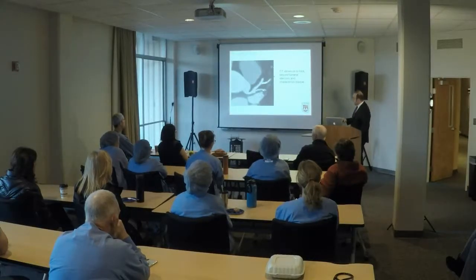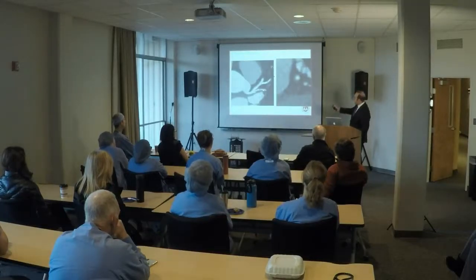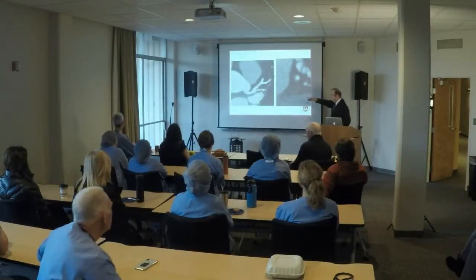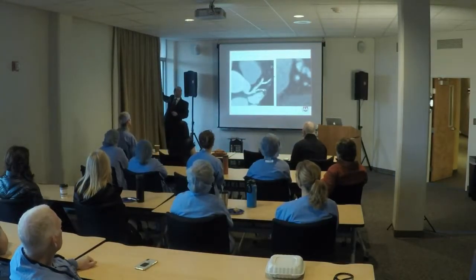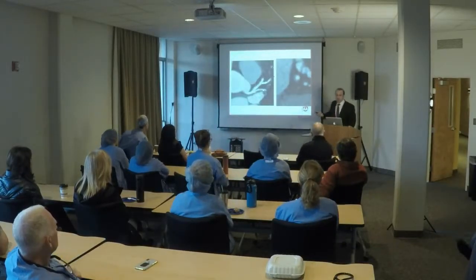Okay, and remember we were talking about how CT is a 3D acquisition. You can perform these double oblique images and perform cross-sectional views of... is there any way we can maybe shut this right here? You might be able to see it better.